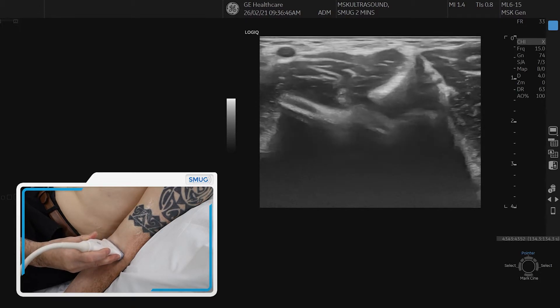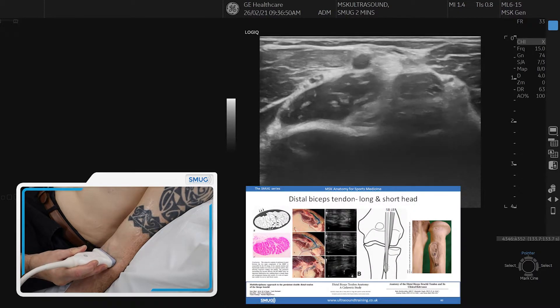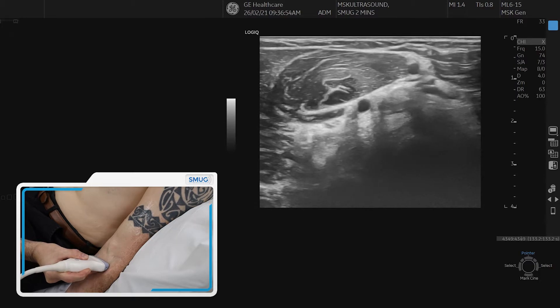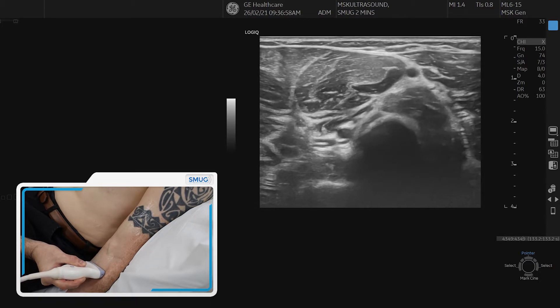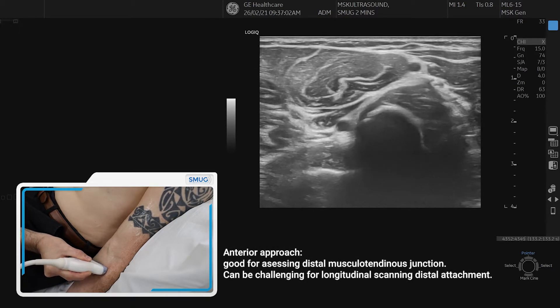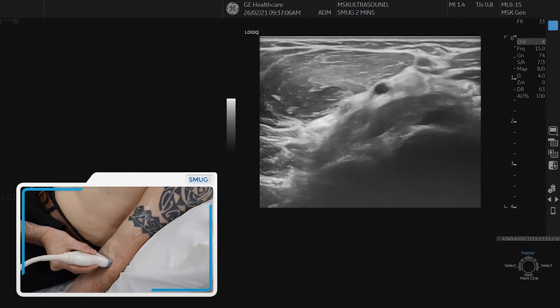If you continue to go distally in cross section, you should be able to follow this slowly all the way through. Then we reach the bony attachment — there's the footprint onto the bone. This is quite challenging, especially if you have a lower end machine, and longitudinal imaging in this approach is also quite challenging.